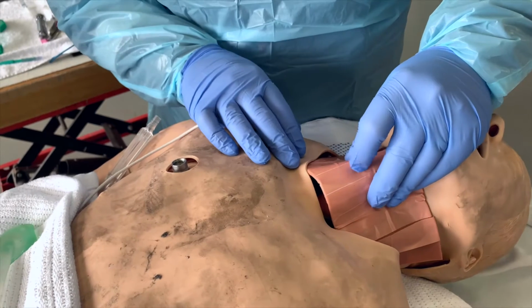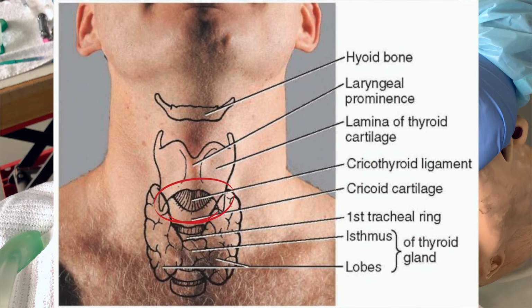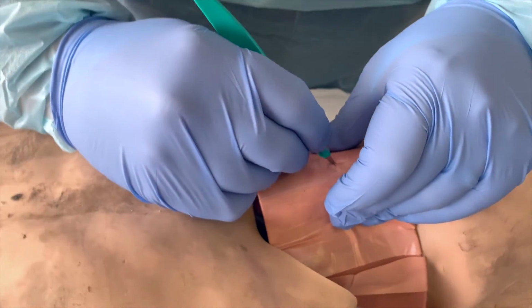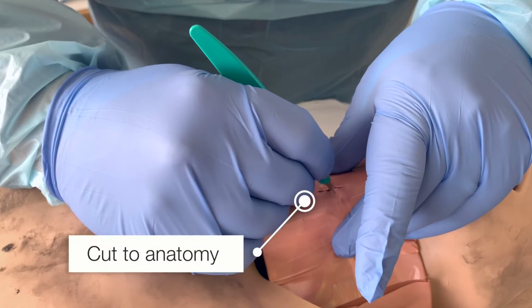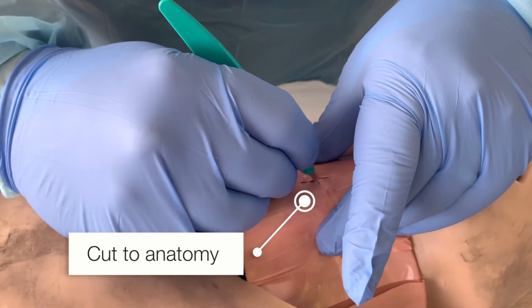Firmly grasp the identified larynx and stabilize it with the non-dominant hand, ensuring that the skin is held taut. Now, confirm the landmarks. Note that the larynx will move if the patient is spontaneously breathing. Using the scalpel, make a 4 to 5 centimeter midline vertical incision through the skin and subcutaneous tissue to reveal the underlying cricothyroid membrane. That is, cut to expose the anatomy.